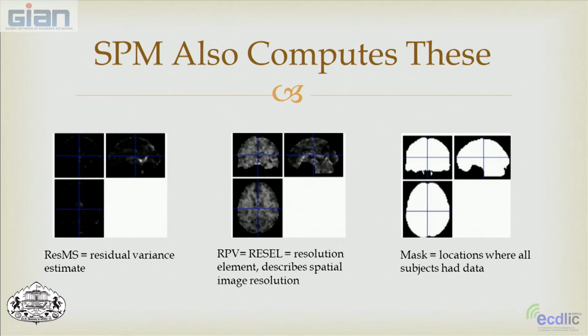Here. That occurs because this is an area where the sinuses are, and there's a lot of tissue variation going on very quickly. So sometimes the collection programs have trouble distinguishing what the intensities really are in these regions. It's due to an error called susceptibility artifact, where it's having a hard time because the tissue is varying in intensity so much in these small spaces. So this leads to what's called signal dropout.